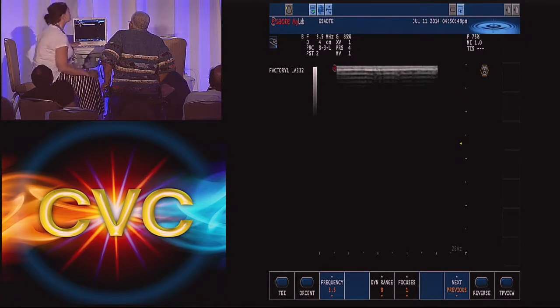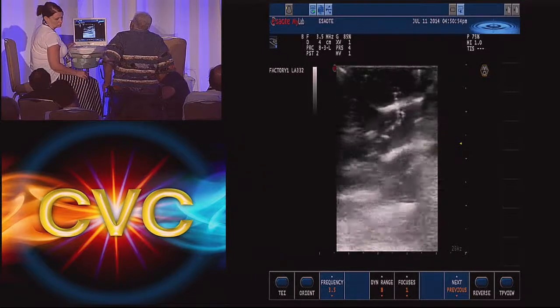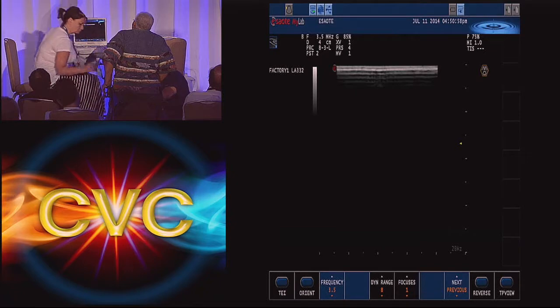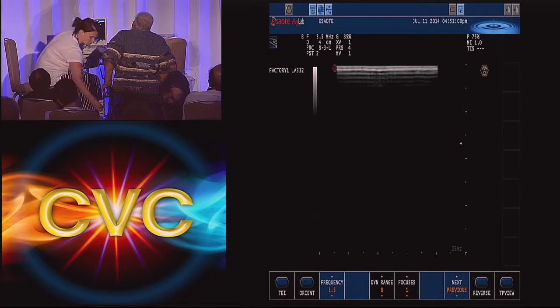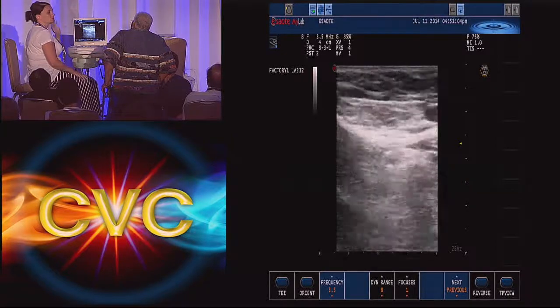So those are the things you have to appreciate. And then from that refluxing segment, which was dilated, you notice that when it split, the size wasn't that big. That means that pressure is refluxing into some other branch, and you chase it around.